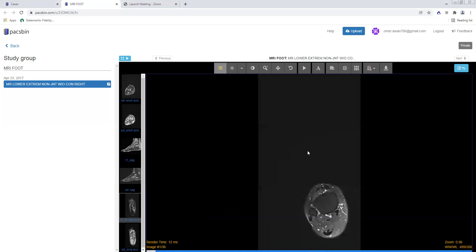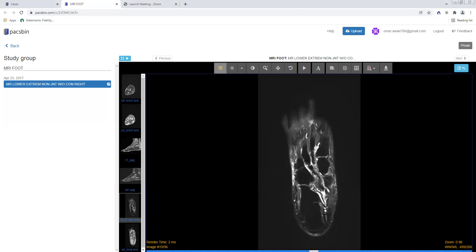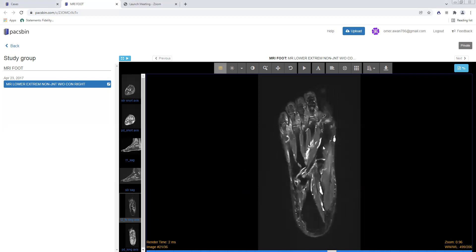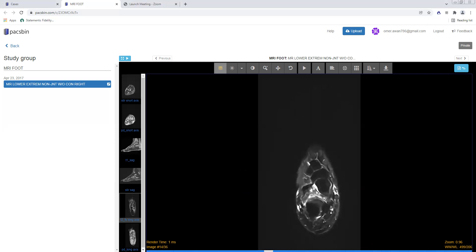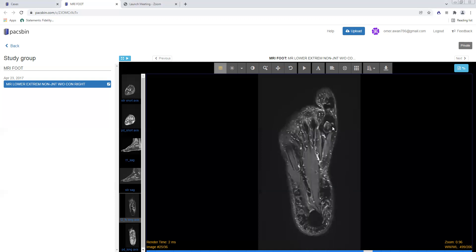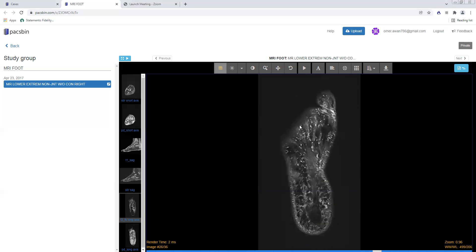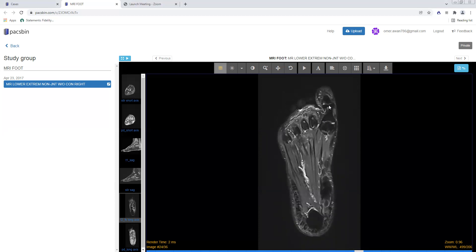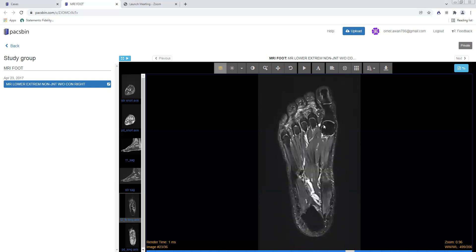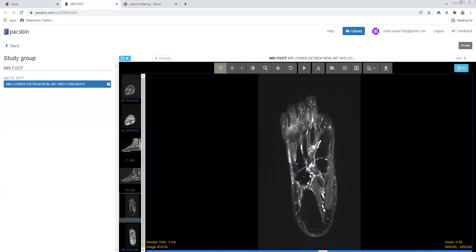Turning to the T2 fat sat long axis axial images, you're looking for any bone marrow edema to suggest a fracture, AVN, or degenerative changes. Most of the bones look completely normal here, but there is a little bit of cystic change along the calcaneocuboid joint suggesting mild degenerative changes, and a little cystic change at the first MTP joint. There's no marrow contusion, no fracture, no marrow proliferative or replacing processes. You also want to scrutinize the joint spaces — the MTP joints, IP joints, TMT joints, navicular cuneiform, talonavicular, and calcaneocuboid — none of them have large fluid collections.